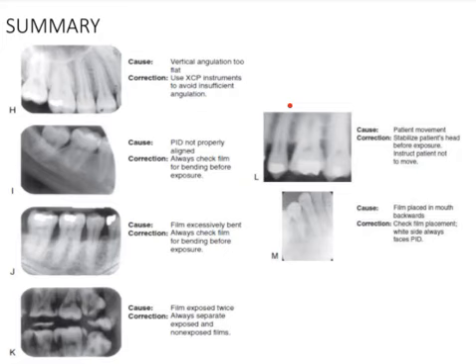Then the film placed in the mouth backwards. That means the backside projection. Okay. In the case of backside projection, that means the lead foil is on the backside and the backside is angulated towards the X-ray tube. So in such a case, you can either get a tire track appearance or a herringbone pattern along with a light radiograph. Okay. So these are the errors that you have to know.